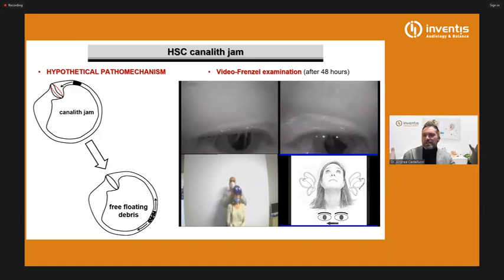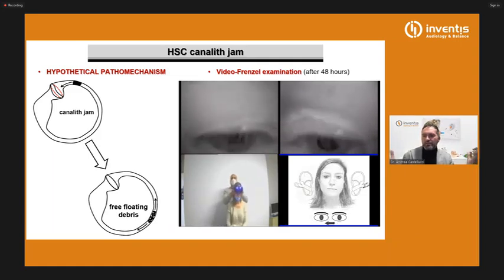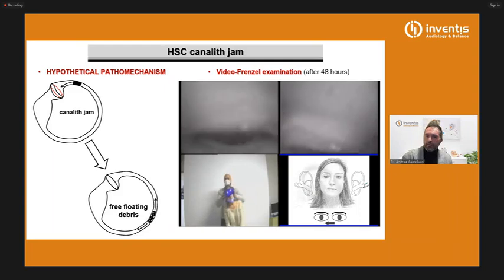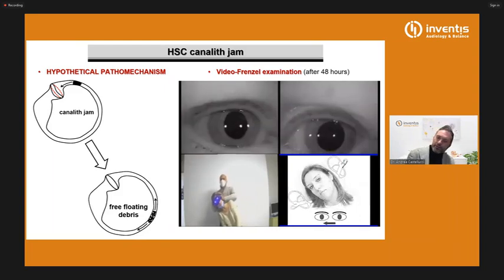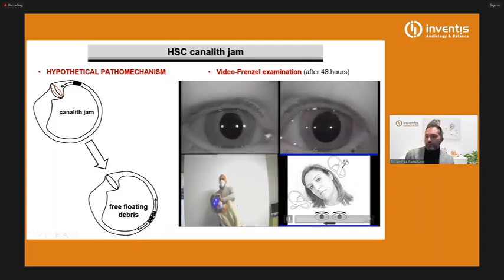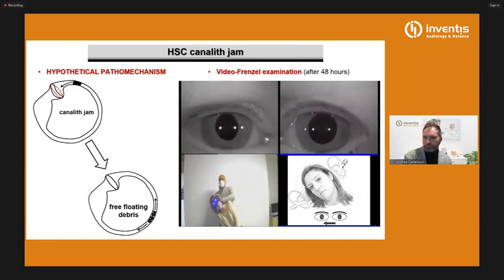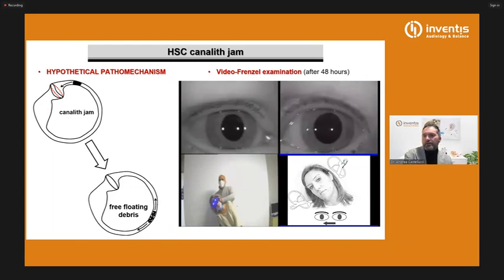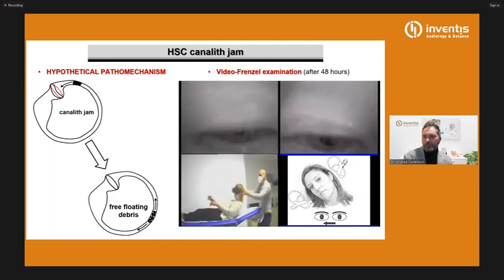It's typical head pitch test for the horizontal canal BPPV of the geotropic form, due to otoconia in the non-ampullary arm. Now, upright headroll test on the right side, and otoconia are going away from the affected cupula. So we have a right beating nystagmus. So it eventually converted in a typical geotropic form of horizontal canal BPPV.